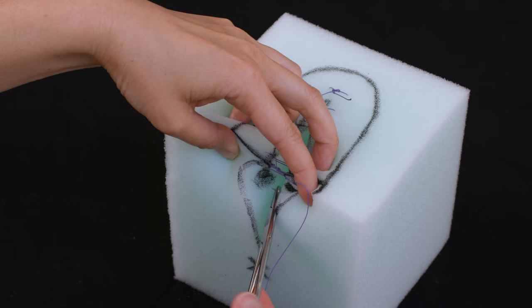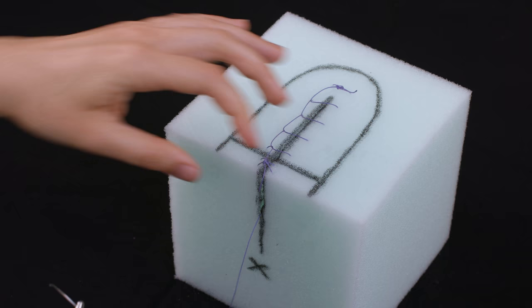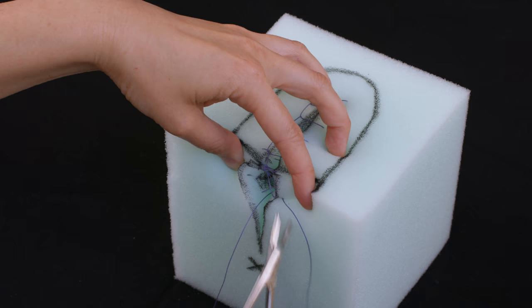I'm right-handed, so my first bite is on the right side. You'll probably need to reload your needle to do the second side. The placement of your bites on each side should mirror each other, and the knot will be towards you.